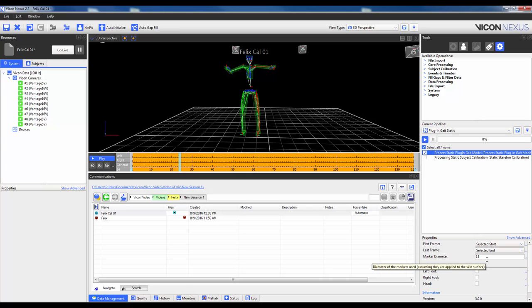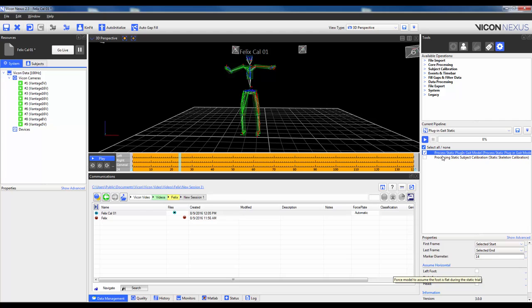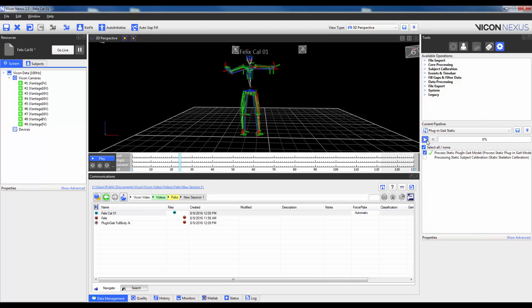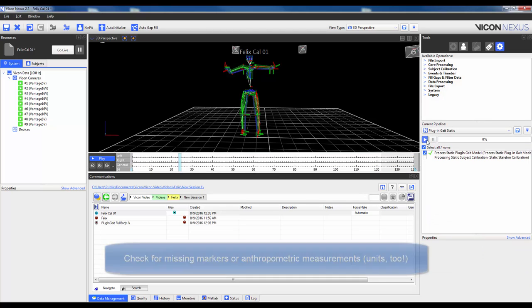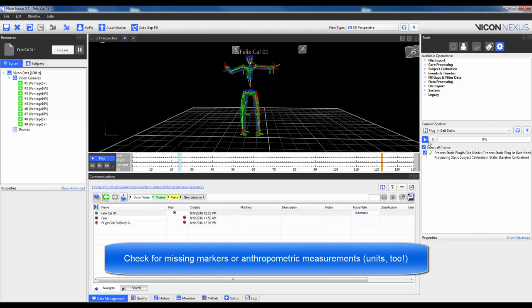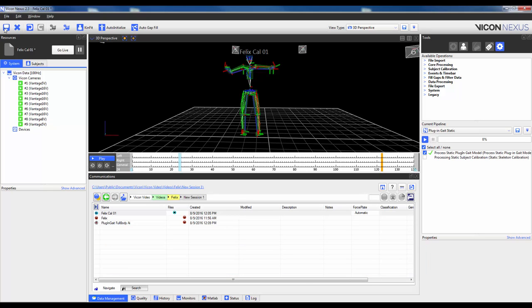When you're sure that the settings are correct, go ahead and run the pipeline, so I can just run the entire pipeline operation here. If this pipeline fails, the main causes are either a missing marker or a missing anthropometric measurement. Lastly, make sure to save the trial.